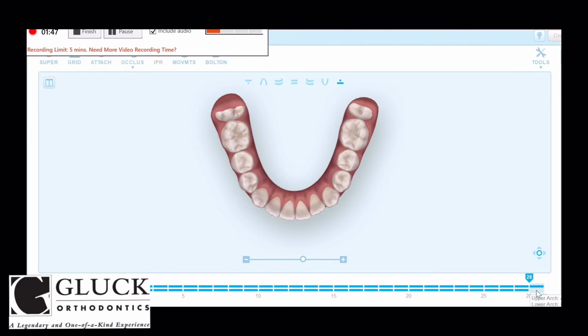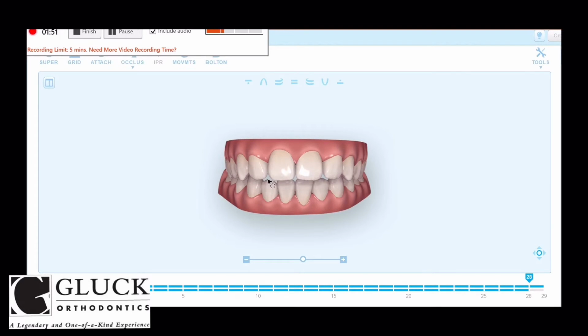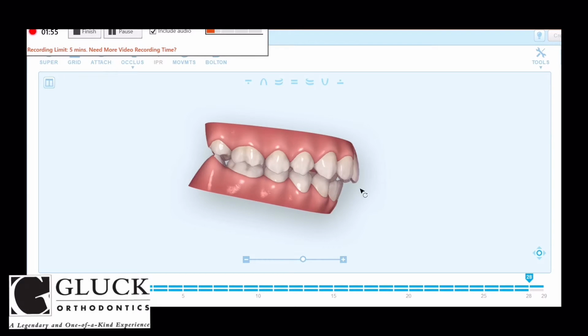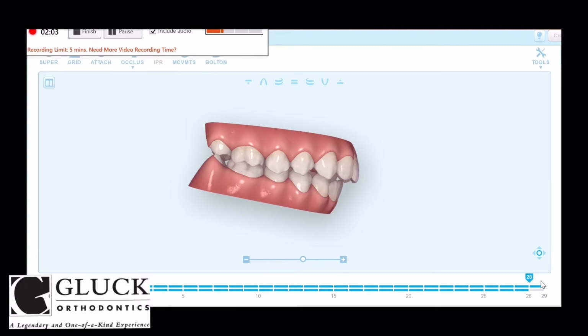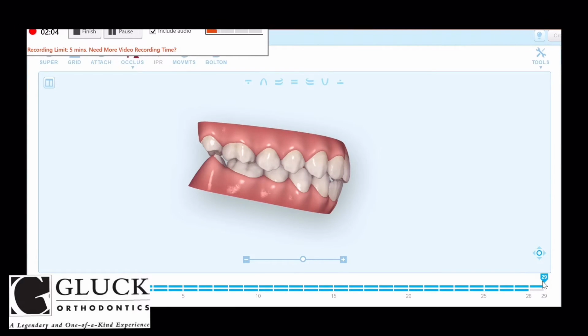And so what you're looking at right now, we're at aligner stage number 28, is straight teeth. We have the up and down overbite fixed, but that forward backward overbite is not fixed. And so as I go from stage 28 to 29, you'll see in one stage the bite changes. That's what we call a bite jump, which happens when the patient wears rubber bands.